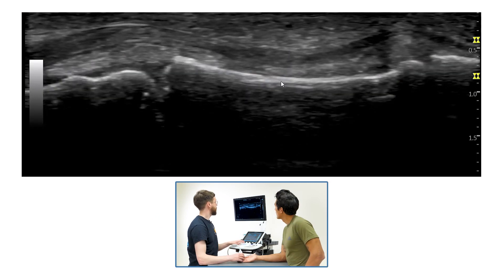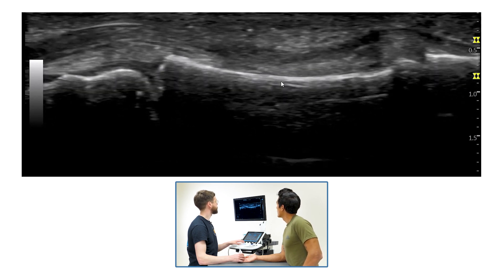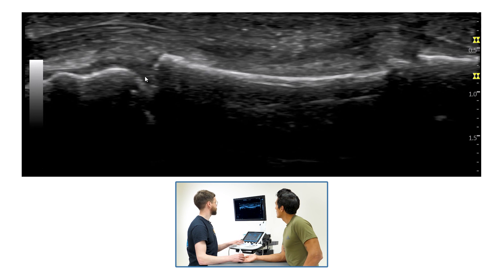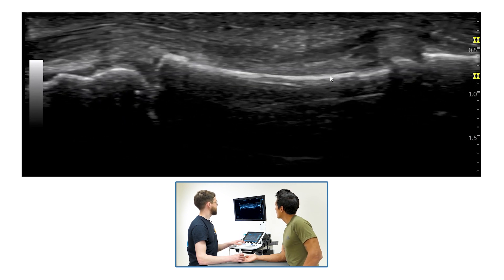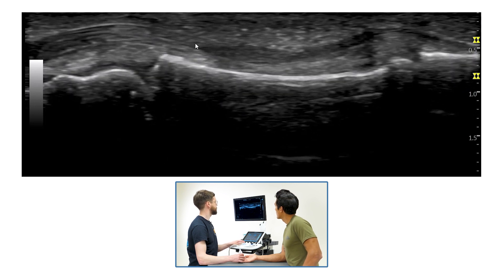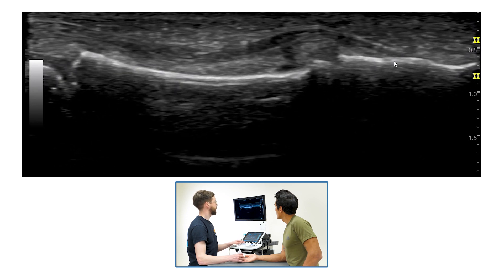When looking at the A4 pulley, we are looking in the area between the proximal interphalangeal joint, which is visible on the screen here, and the distal interphalangeal joint, which is here. In terms of the other structures we can see, the flexor tendons dive down here and then come back up and attach here.